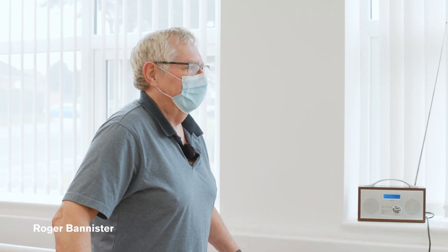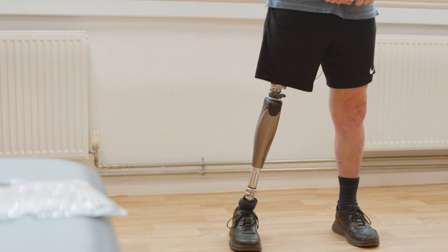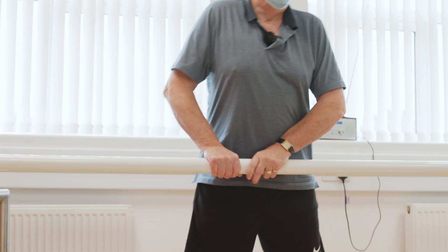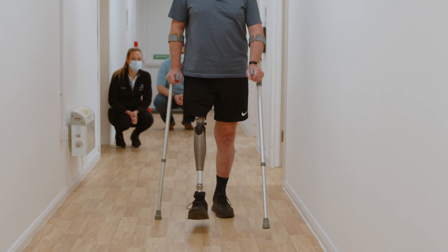Totally different. I can feel the weight actually going up through my bone, as opposed to something spongy on my leg. Very positive. When you're using a socket, your foot can be anywhere within four inches of where you think you're putting it — it's vague. Whereas the instant I put this on this morning, I knew where my foot was.